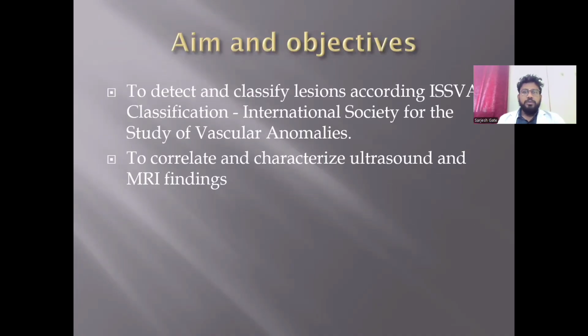Aim and objective of this study: to detect and classify lesions according to the ISSVA classification, International Society for the Study of Vascular Anomalies, and to correlate and characterize ultrasound and MRI findings.